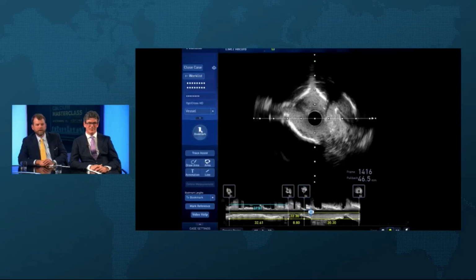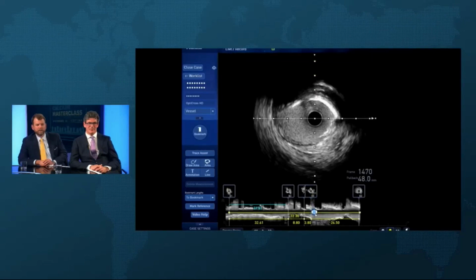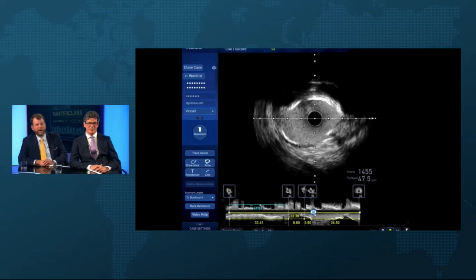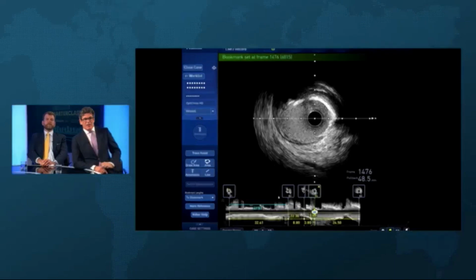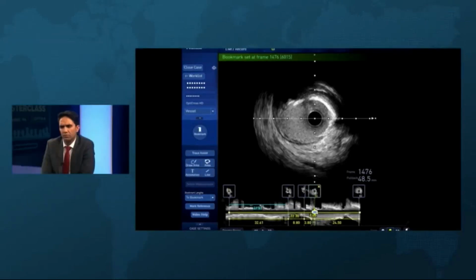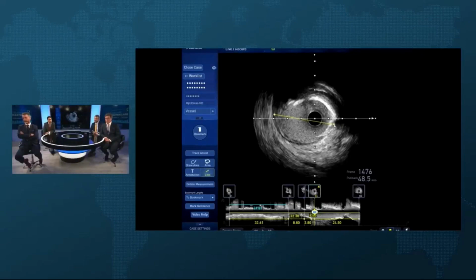So I think we probably don't want to overlap at that kind of aneurysmal area. Would everybody agree with that? Right. We can probably get across it with a 40 if we wanted to do that. But I think if we took a guide extension, pretty far. You should be able to get that. What size is 48 approximately?